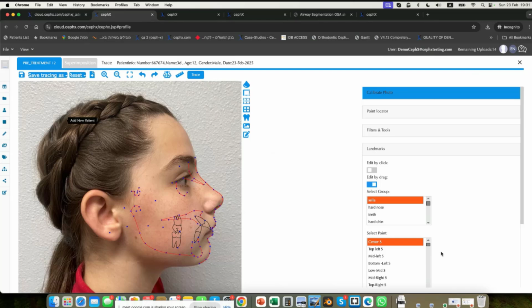Yeah, was there anything else? Daniel, we didn't talk about the Ceph from CBCT, I believe, and also maybe the annotation tools. Not sure it's relevant, but no, I don't think annotation tools are so relevant.